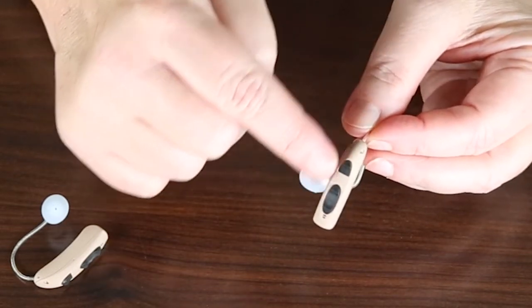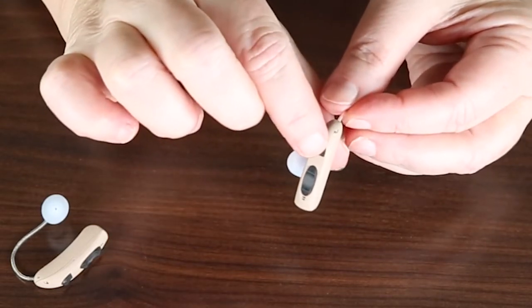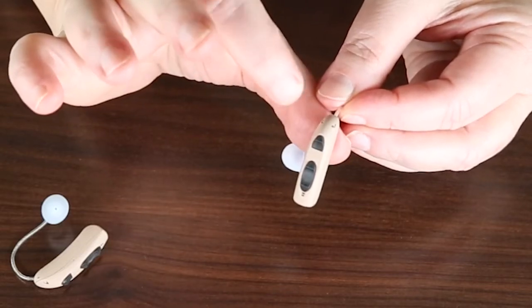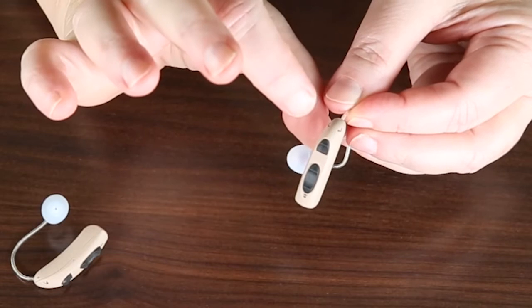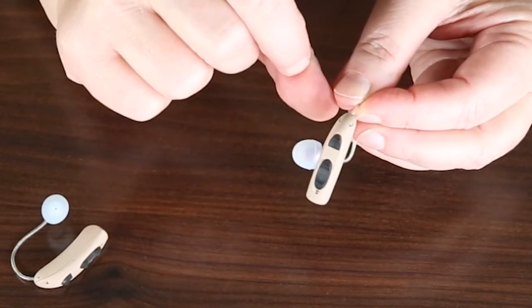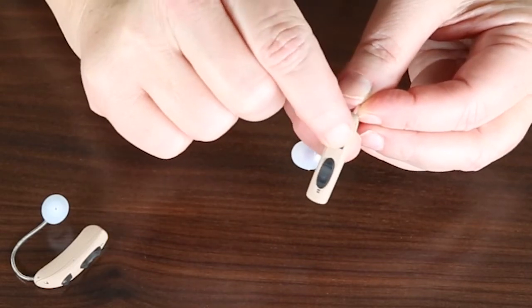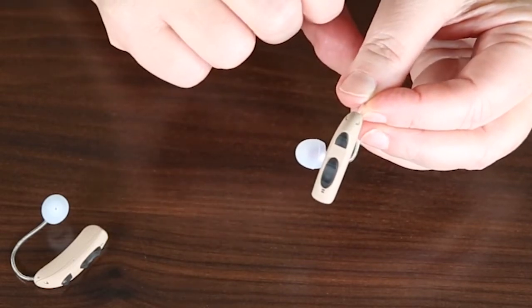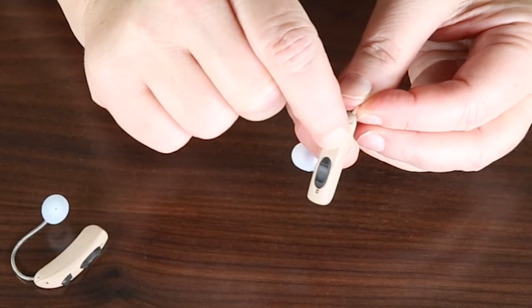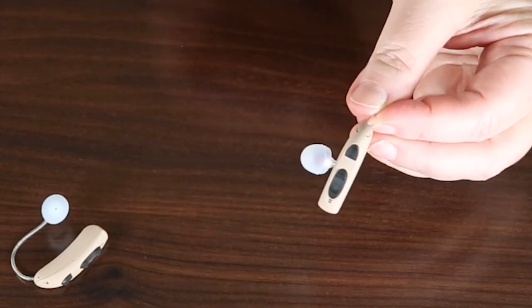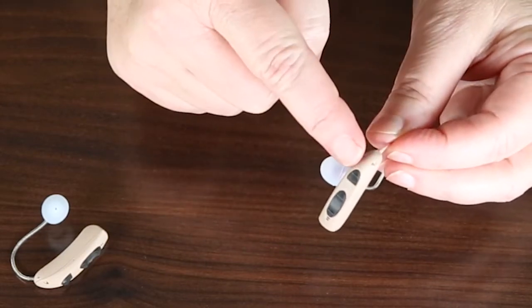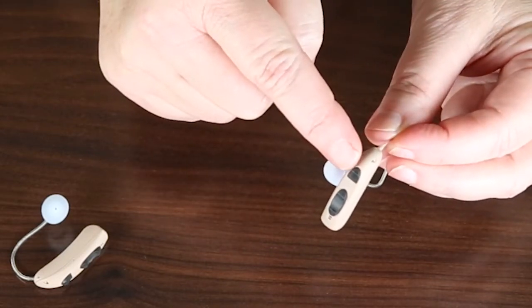Depending on the situations that you are in, you can change the program button by doing a short press. There are four program options with this one. Program one is for more mild hearing loss. Program two is when you're in noisy situations. Program three is a moderate hearing loss, so therefore it's going to be louder. And then program four would be like a more outdoor noisy area. So you can access that by doing a short press on the power button.